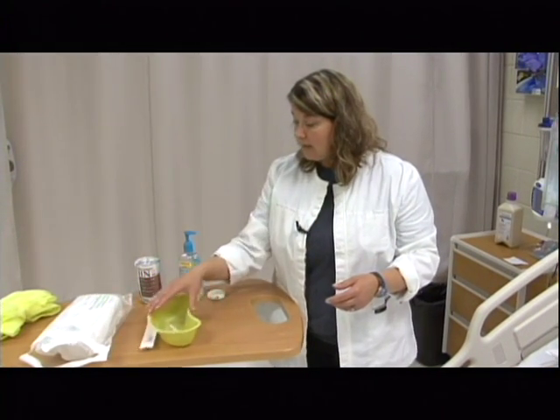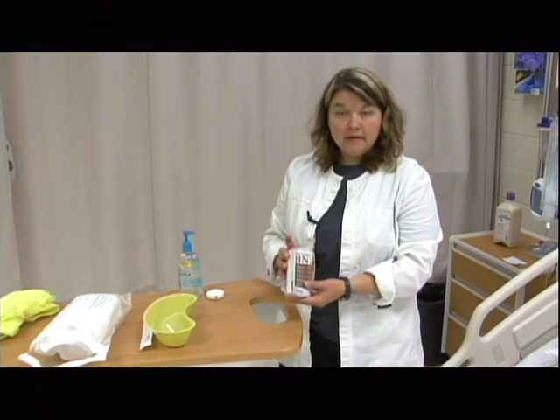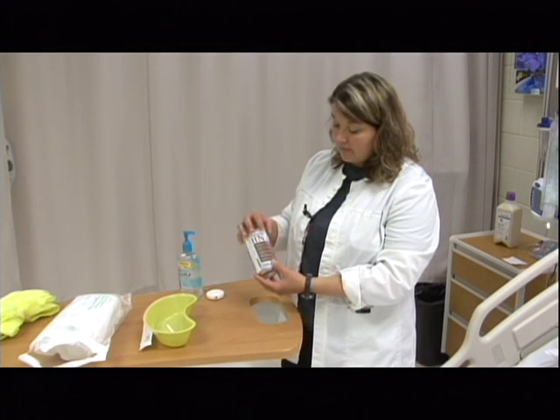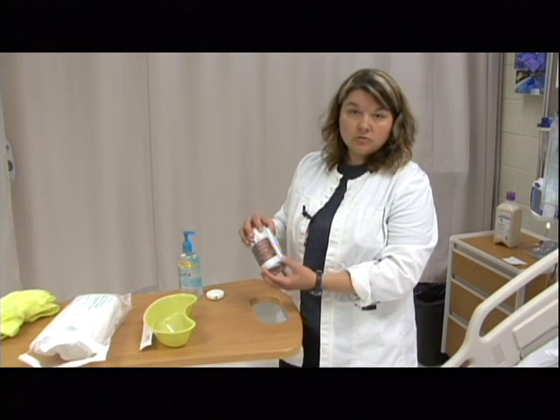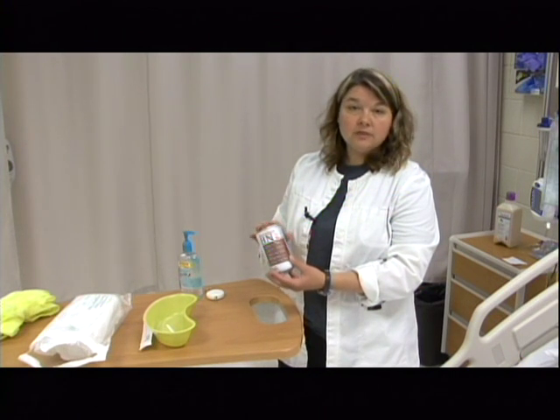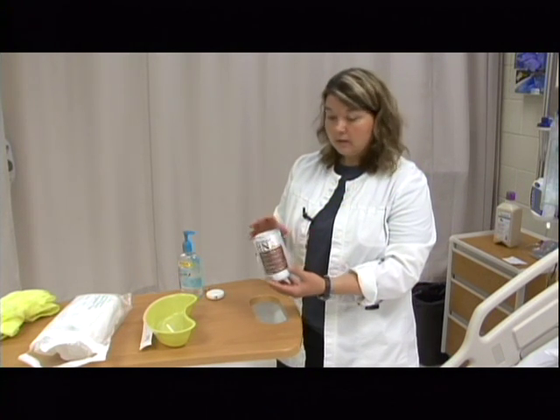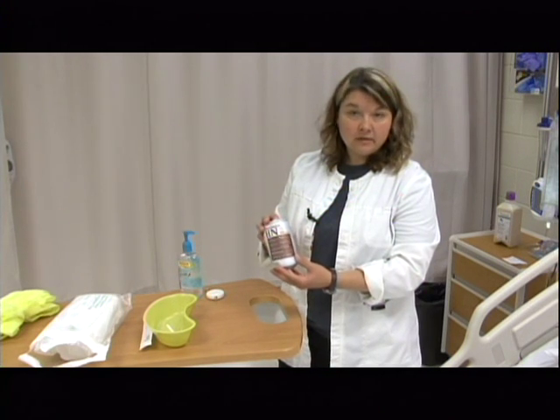Now, as I'm going to be giving the tube feed, I would need to have whatever tube feeding that I have. And at this point, I'm going to give what we call a bolus feeding. So you need to make sure and confirm that this is the correct type of feeding that is ordered for your patient. You need to check the expiration date and make sure that it is within the date and time. You need to make sure that it is a closed container. Okay, and then if you're using cans of food, these need to be disposed after each feeding. You cannot hang on to them once they've been opened, because they lend themselves to bacteria, and then you could infect your patient.